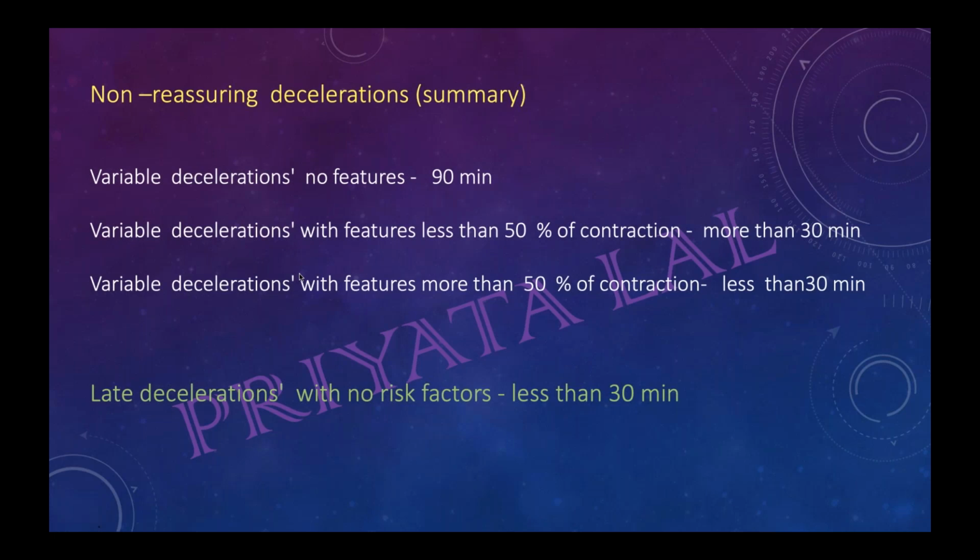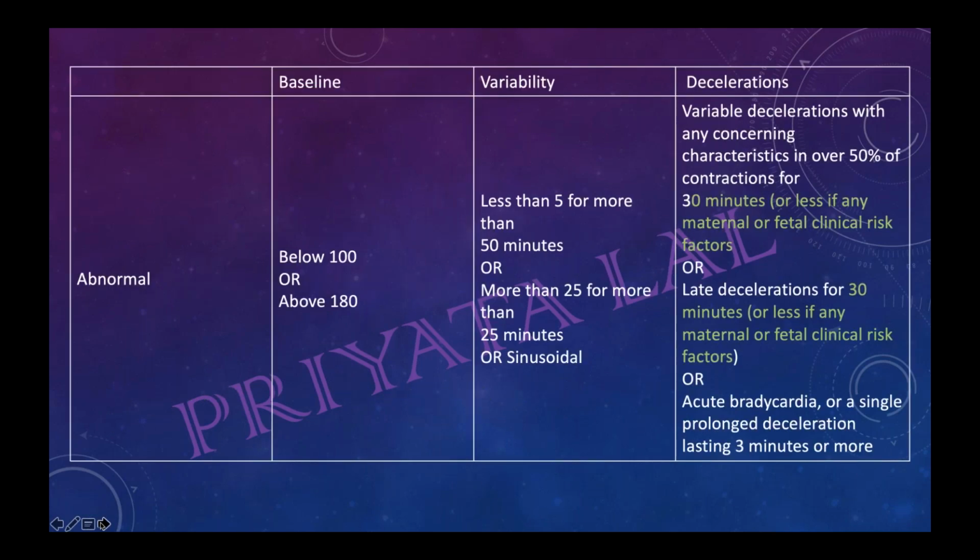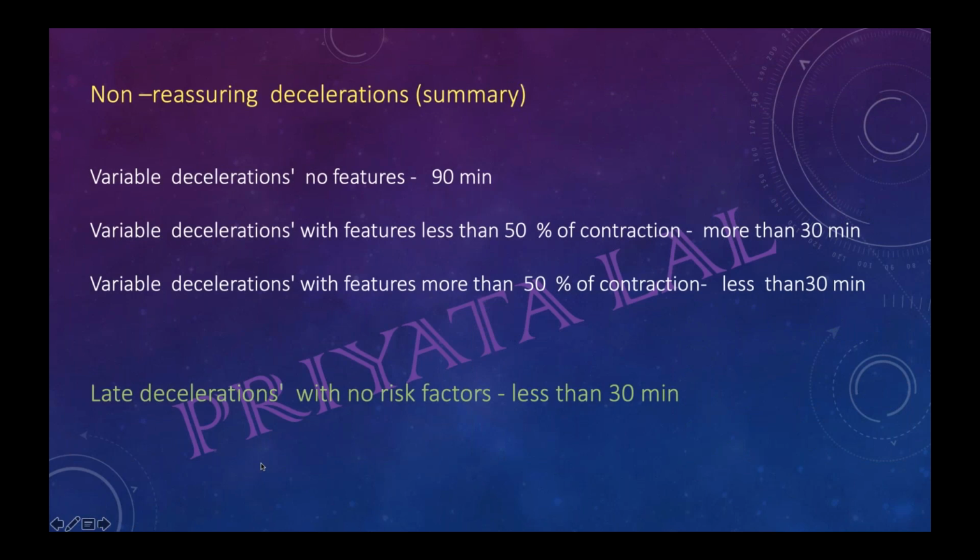Yes, that will be in the scenario, I think. That scenario will be given where they will tell us the time duration and all. They usually give a 30-minute or 40-minute trace. But in the question they can give it in written format, that it is 90 minutes. Part 2 people, they can give it in written form. This you have to remember only.